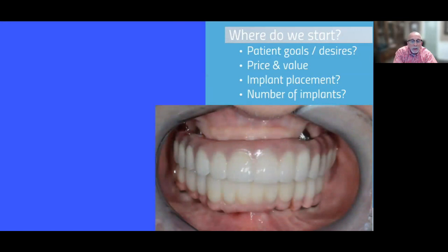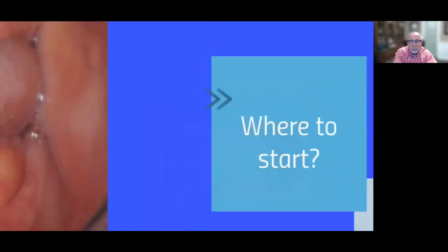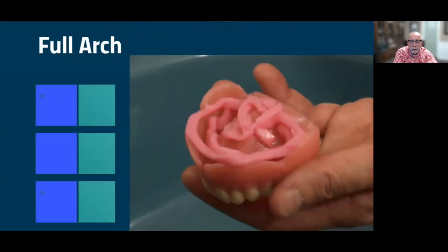And this was a patient who had an All-on-X case that every time she smiled big, if she had a big smile, laugh, her upper lip would get caught between the restoration and her tissue, and she'd have to reach up and pull it down. So she needed more acrylic up there. And obviously we can't do that with a fix because she couldn't clean it.